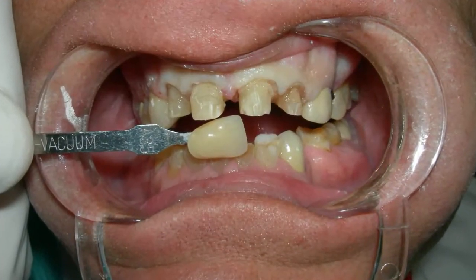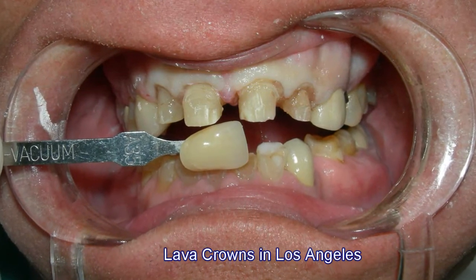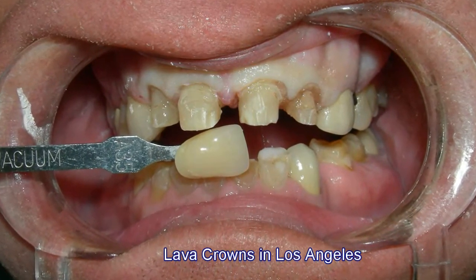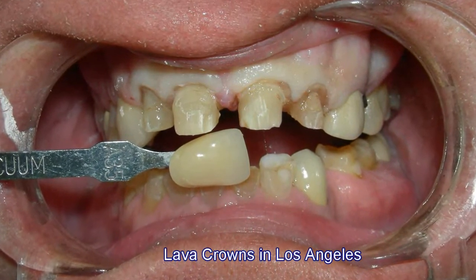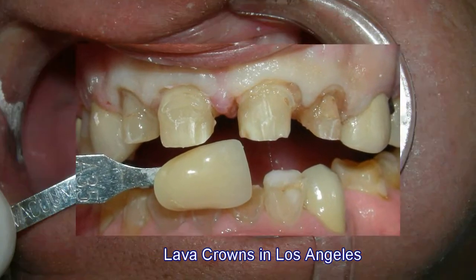We matched the shading of the lava crown to create a more realistic appearance in the mouth. And as you can see, the lava crown itself is actually very thin and able to be attached to the original teeth.